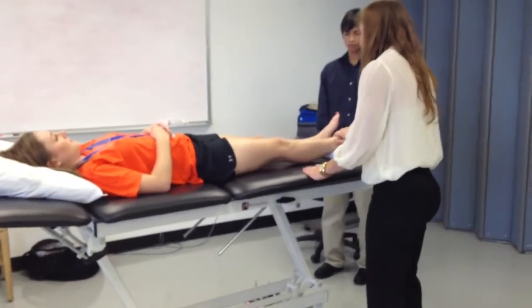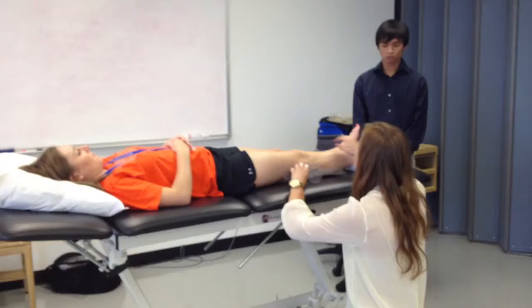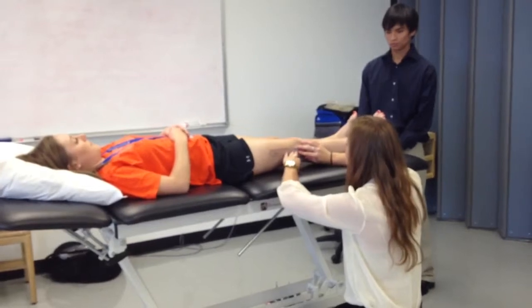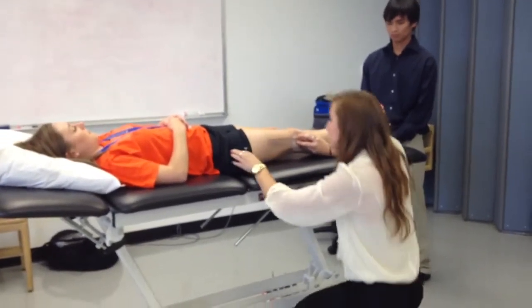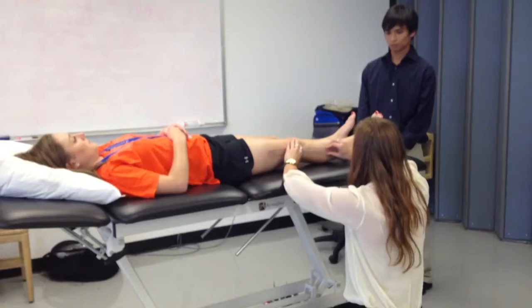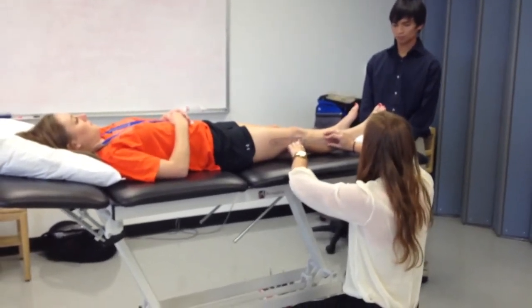When aligning the goniometer, center the fulcrum over the lateral epicondyle of the femur. Align the proximal arm with the lateral midline of the femur using the greater trochanter for reference. Align the distal arm with the lateral midline of the fibula using the lateral malleolus and fibular head for reference.